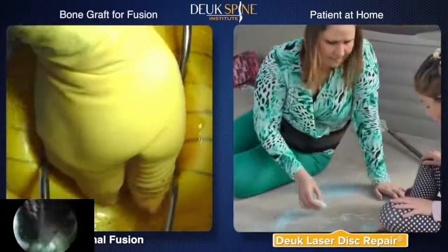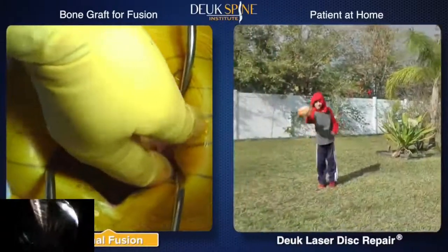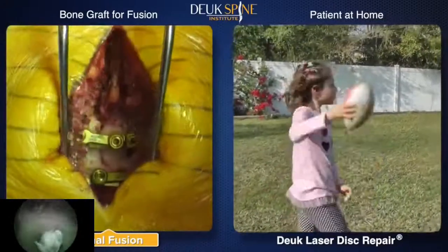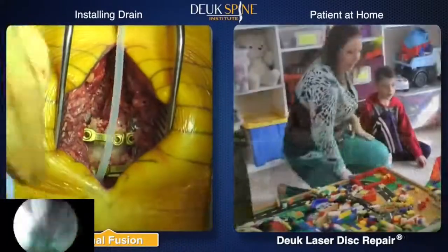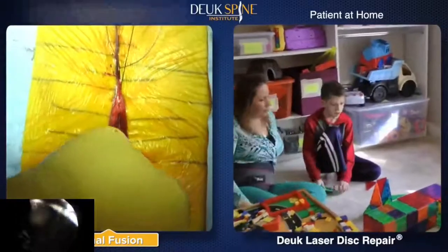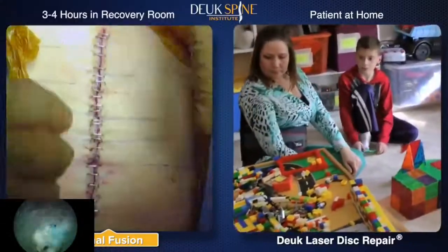Meanwhile, bone graft material is placed throughout the fusion surgery site. These morselized pieces of bone will eventually grow together to help promote the fusion process. Prior to closing the wound, a temporary drain is installed to allow excess fluid to drain. Average surgery time of a traditional two-level fusion is 2.5 hours, with an additional 3 to 4 hours in the recovery room.